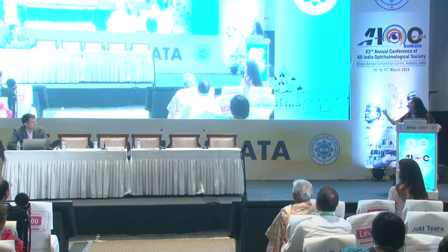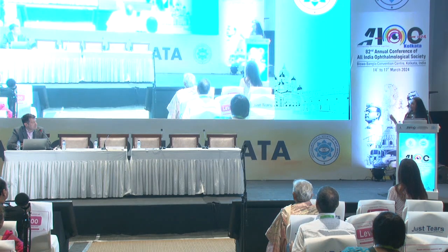That's a great question. I typically do them at the time of cataract surgery, and again, because of my patient population. The post-PK patients, yeah. So I do them at the time of cataract surgery, and I usually combine them with corneal compression sutures because I find that, at least the ones I'm doing these on, the amount of astigmatism they have does not completely get corrected by your nomogram. And I always over-correct with the sutures, and that way you can always take them out. So I use my sutures as sort of the adjustment.